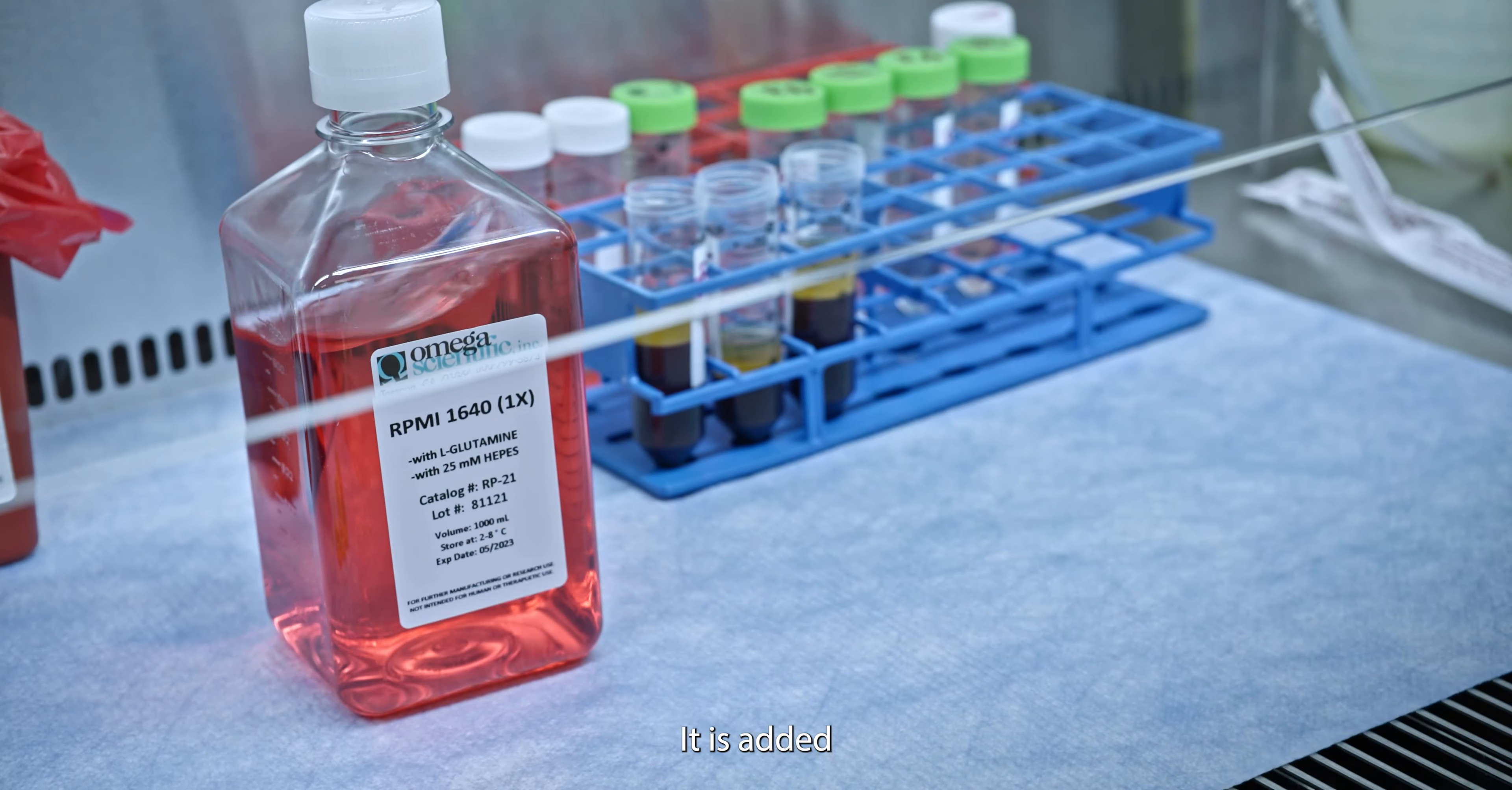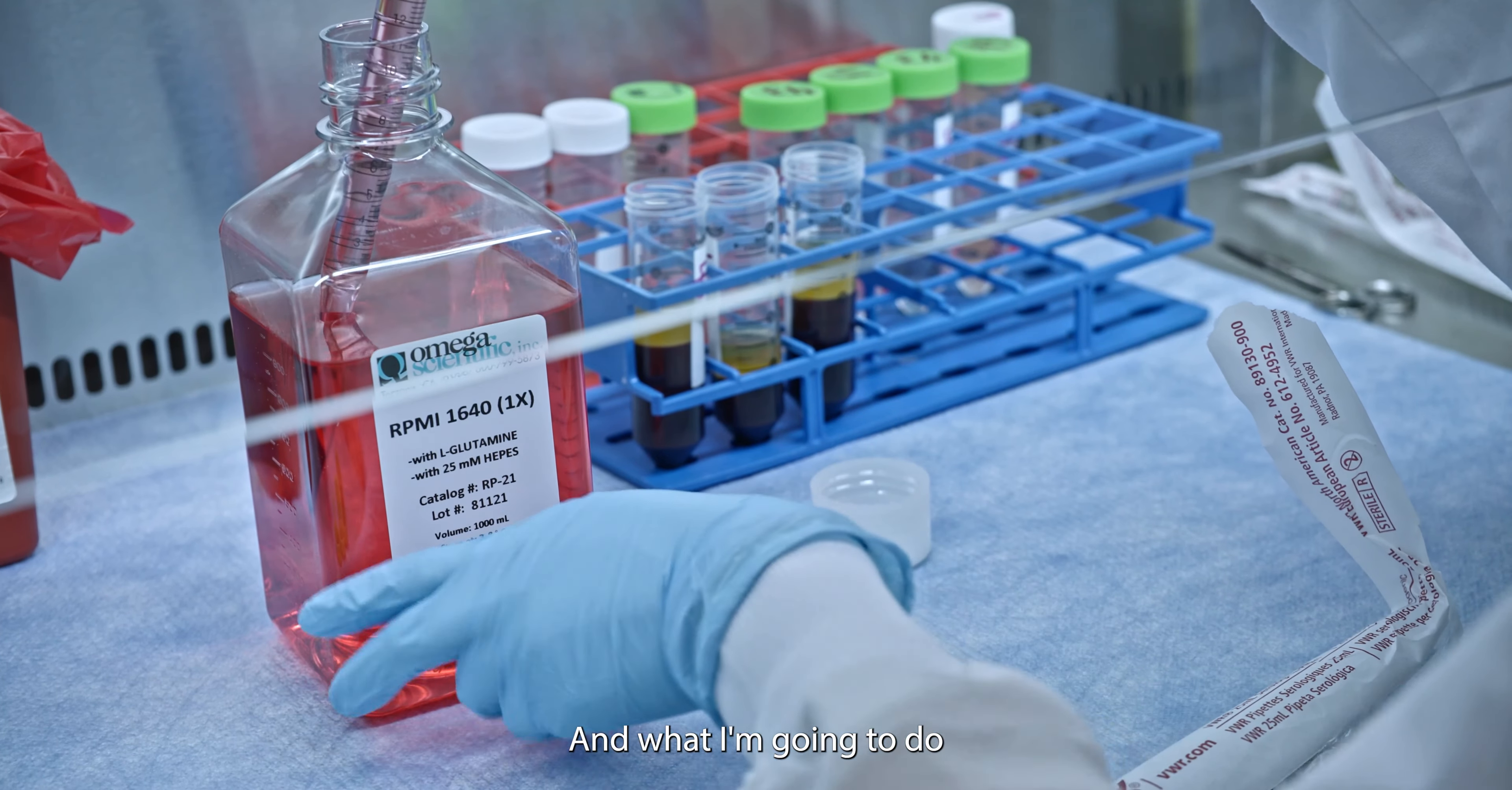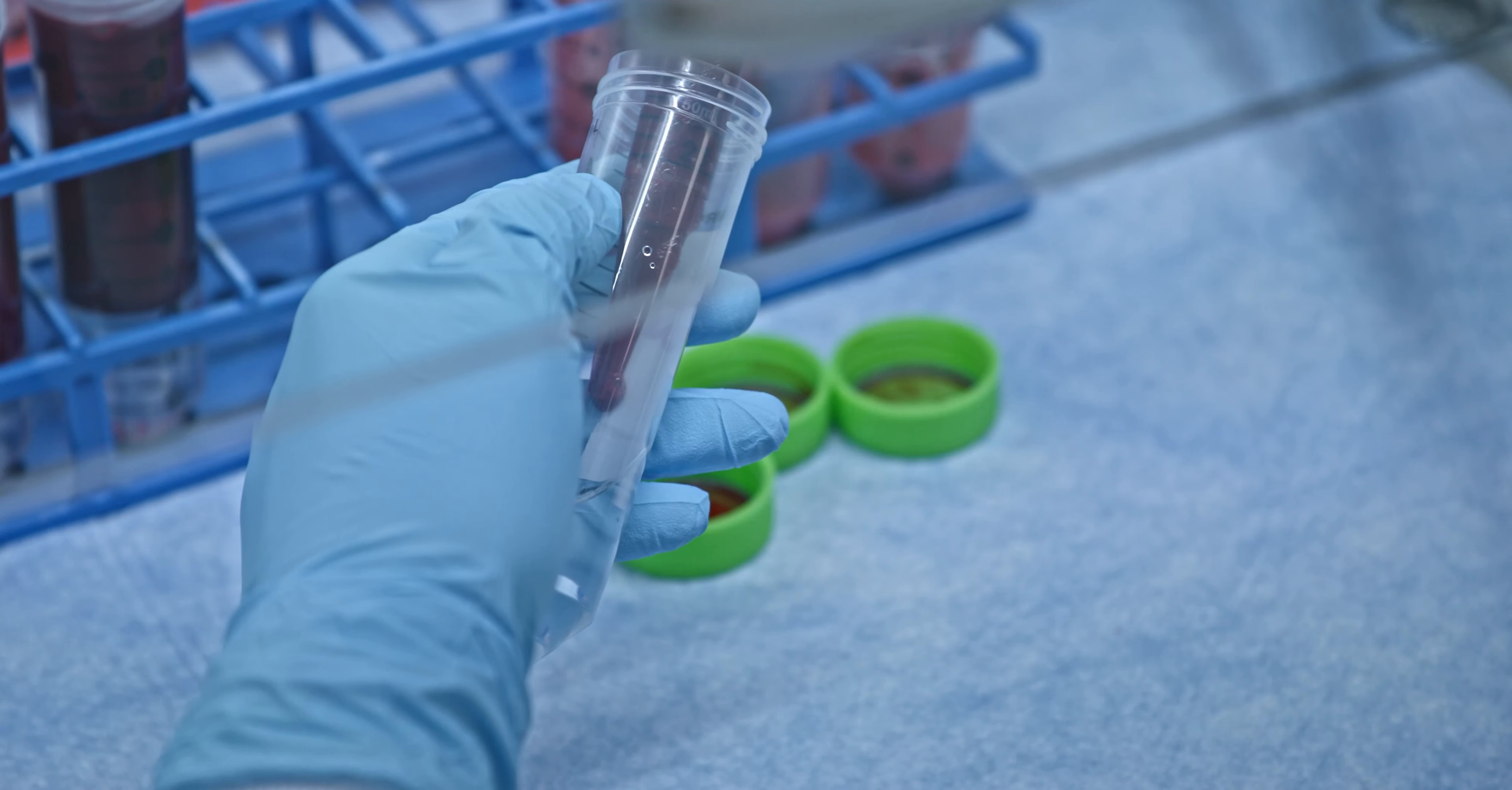It is added nutrients to keep all the cells healthy. And what I'm going to do is add our RPMI back to the samples to dilute it back to its original volume, just so that it's a good viscosity to layer over Ficoll.